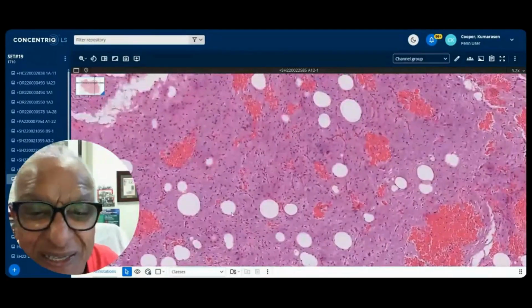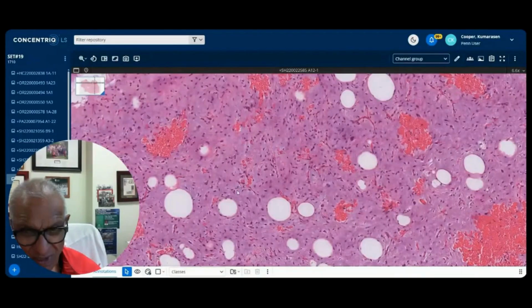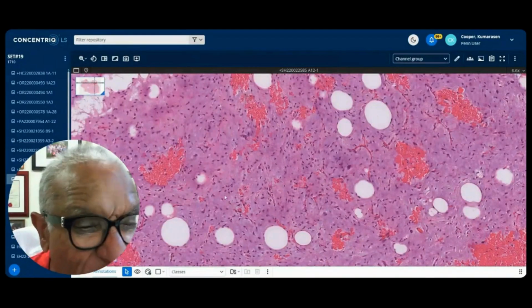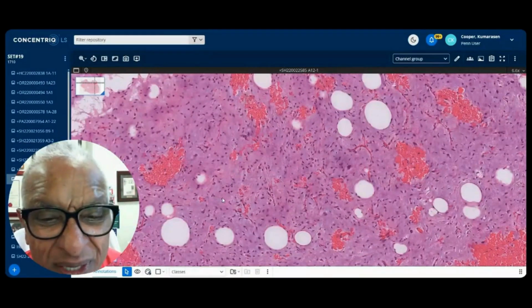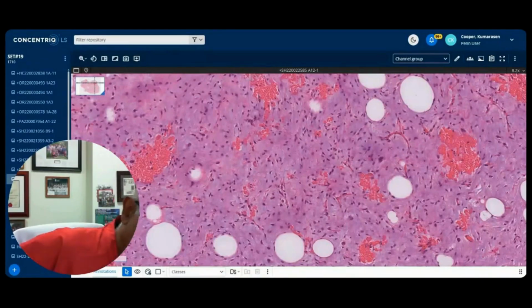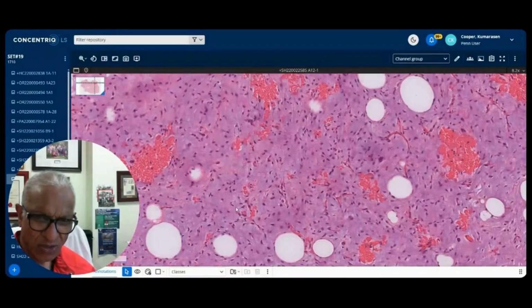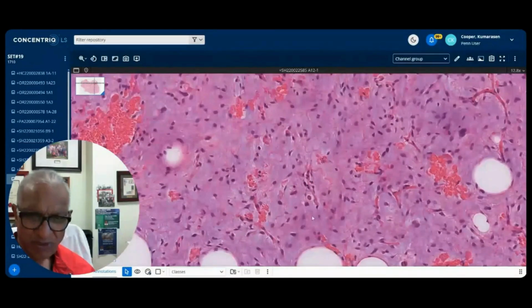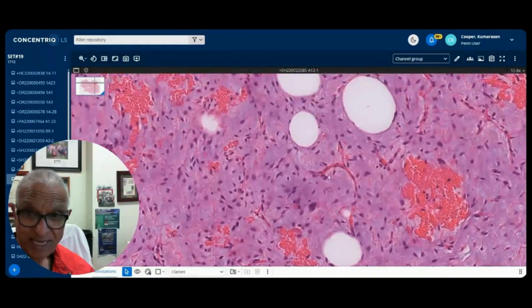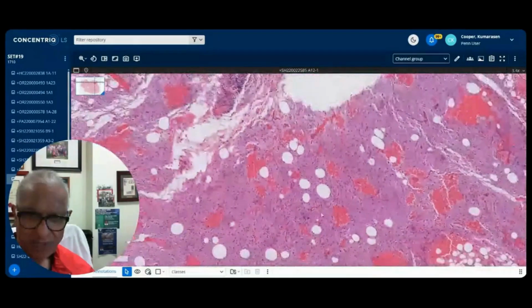Okay, I'm going to describe it a little to you, but you can appreciate the myxoid stroma, right? That gray blue. We've talked about this in the past. Be careful of edema. Many people call edema myxoid stroma. I've seen that often. You want to see this nice hue before you call it myxoid matrix. And this is nice. This is myxoid material. Also, just point out the delicate vasculature, thin wall, delicate vasculature here.